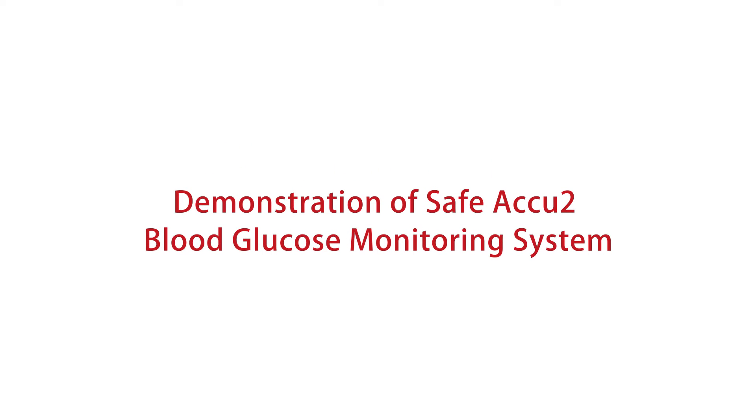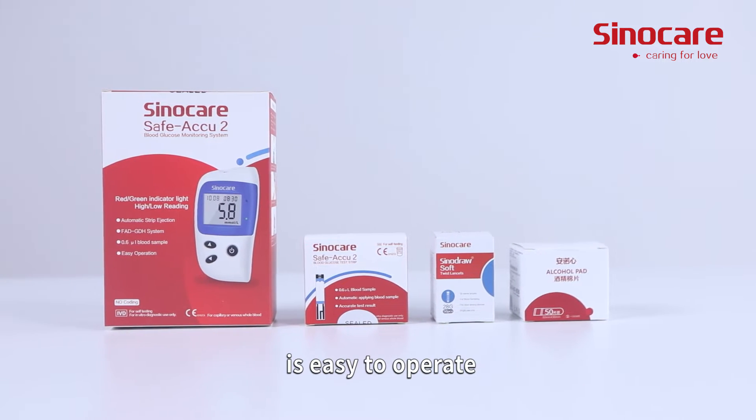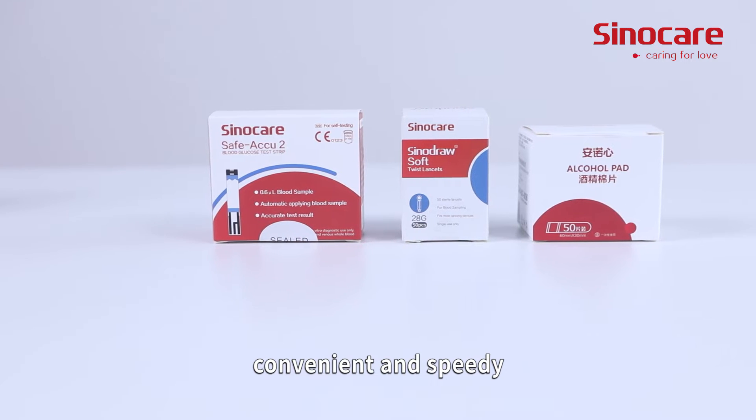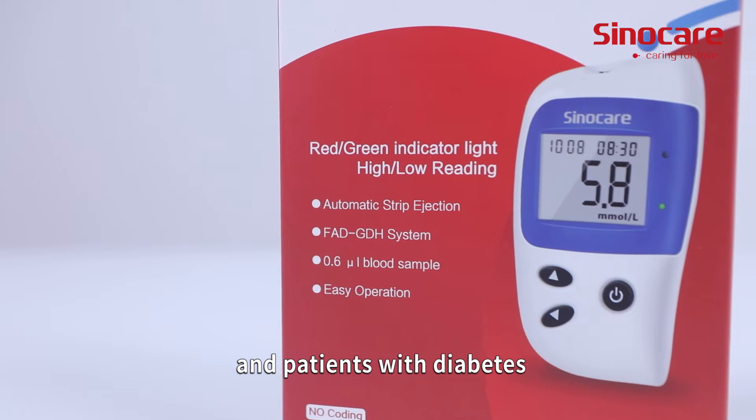Demonstration of SAFE-ACCU-2 Blood Glucose Monitoring System. The SAFE-ACCU-2 Blood Glucose Monitoring System is easy to operate, convenient, and speedy. It can be applied to medical organizations and patients with diabetes.